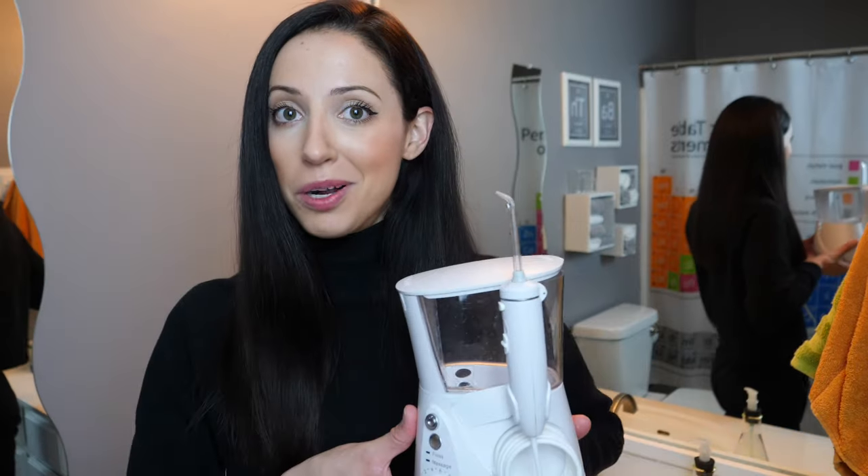Hey everyone, my name is Whitney and I'm a dental hygienist. If you're new here, welcome. If you've been here before, welcome back. Today we're going to talk about how to clean your water flosser.